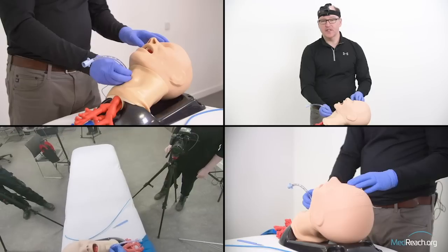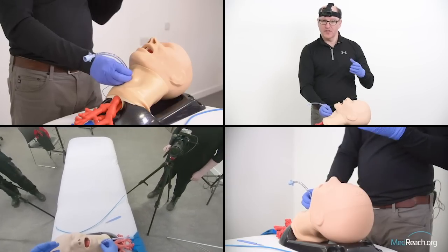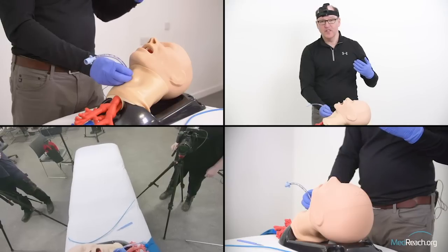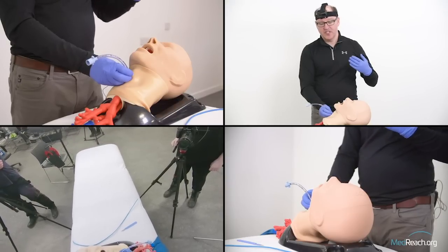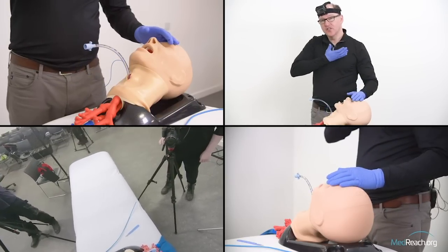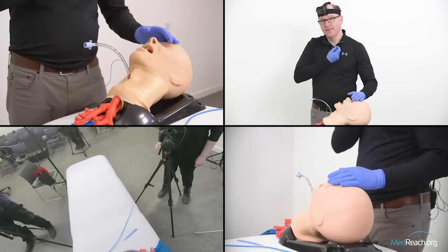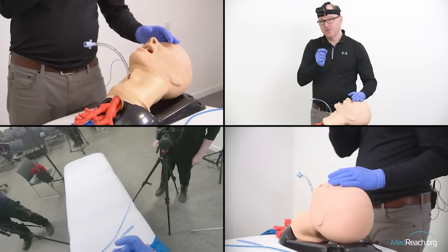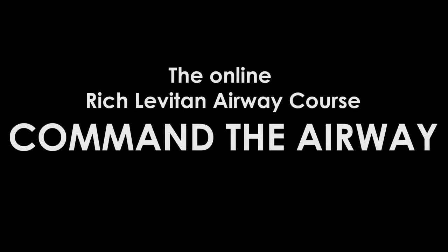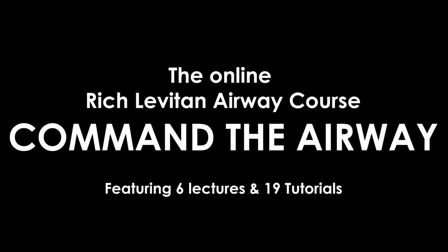The key pieces of this procedure are: understand the cartilaginous cage so you're not cognitively crippled; appreciate the importance of the vertical incision first and verifying the membrane while cutting with sternal hand stabilization; use a small tube — in this case a 6-0 — with a small outer diameter; make sure your finger goes in the hole and widens it before placing the tube; and make sure you don't over-insert.